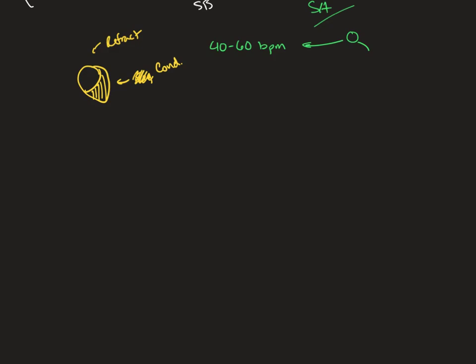And all the radiologists are jumping out of their chairs and getting happy about that because they always say to clinically correlate. Clinical correlation is the most important thing with an EKG, because if you have somebody with diffuse ST elevation, no symptoms, they're young, it's probably benign early repolarization. But if their PR is depressed and their ST is elevated, you've got that slanting of the intervals, and they have some chest pain, maybe it's positionally exacerbated, they might have pericarditis.